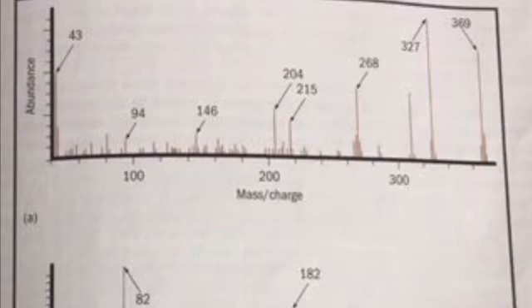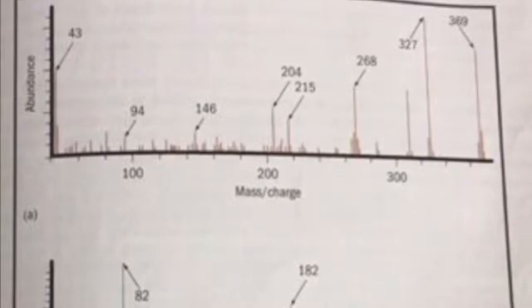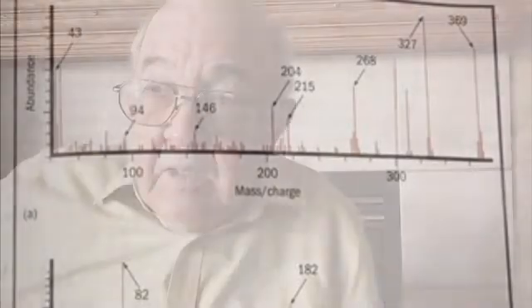So mass spectrometry is used to identify if an athlete has taken a substance which is prohibited by the athletic association. Now most laboratories have a GC mass spec. GC means gas chromatograph, and mass spec is mass spectrometry. So a GC mass spec is standard laboratory equipment in crime laboratories. They are relatively expensive.